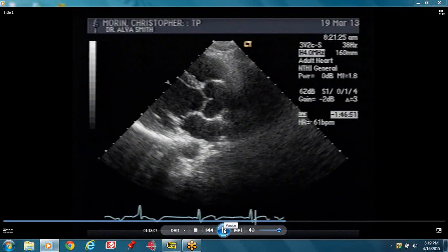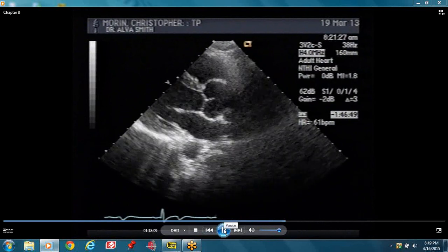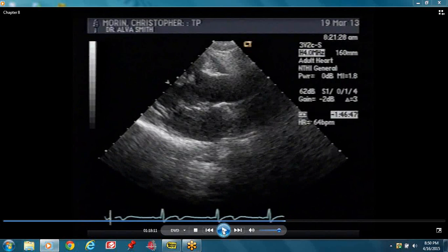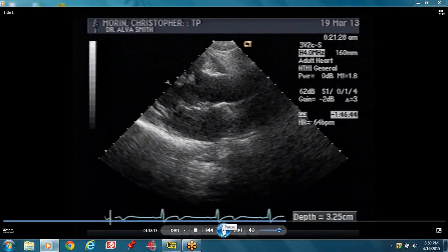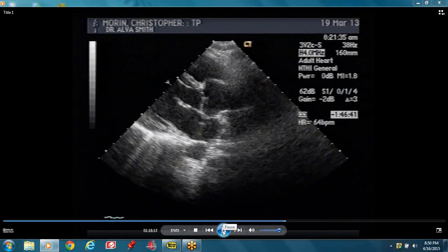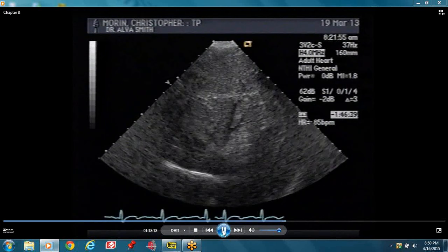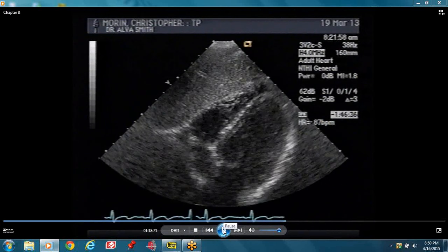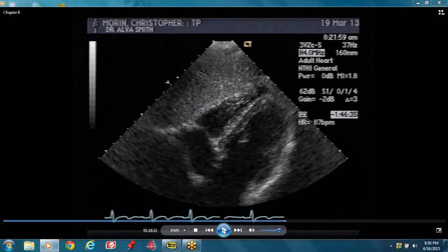She's going to show some measurements — measuring the ascending aorta. This is your subcostal view. This is the liver.